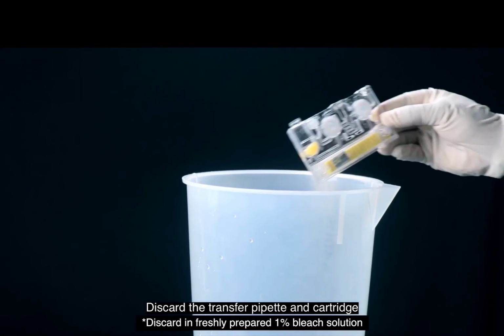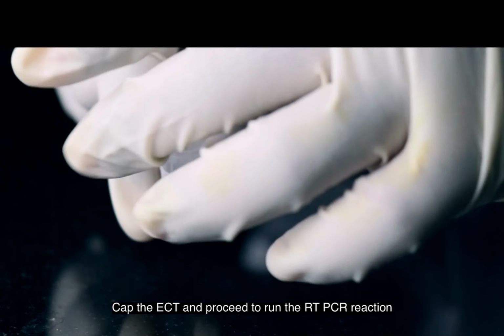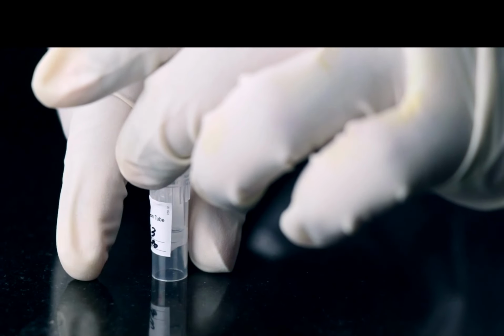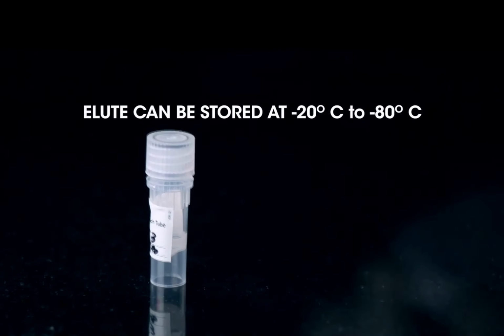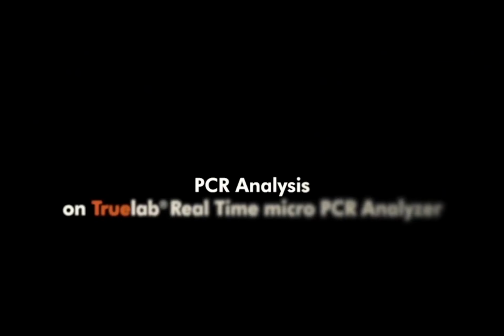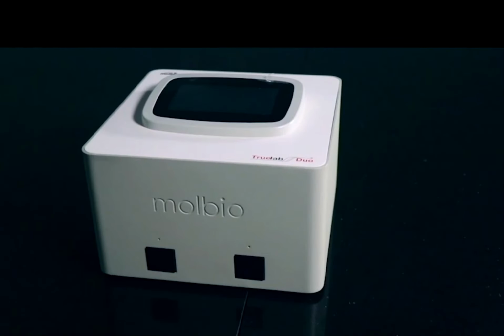Okay, the cartridge also you can discard, close it. So now DNA extraction is done. Now we have to do the PCR. So first test which we do is MTB. Okay, so here is a duo machine. So duo machine, two modules are there. Most of the places here we have Uno machine. It's a single module.